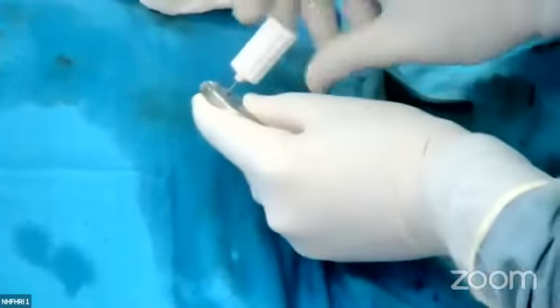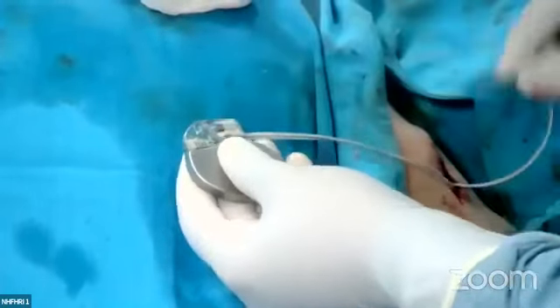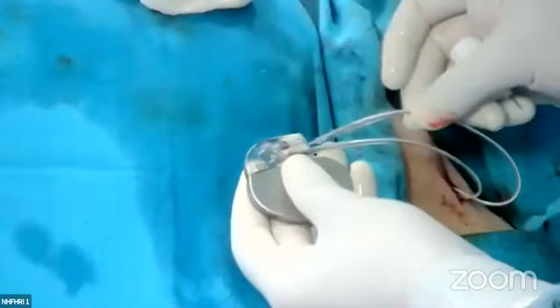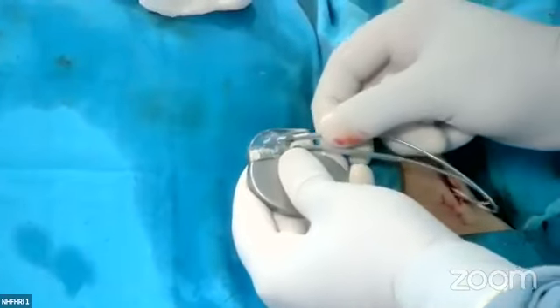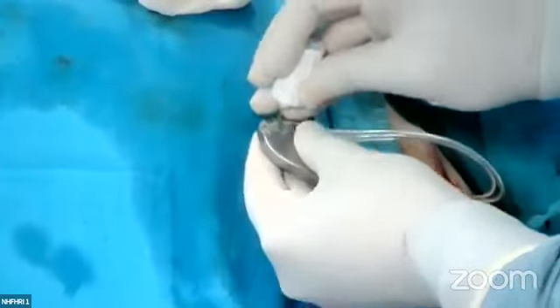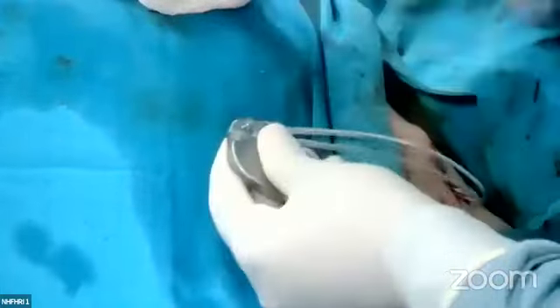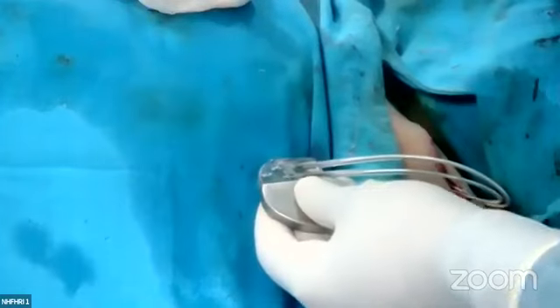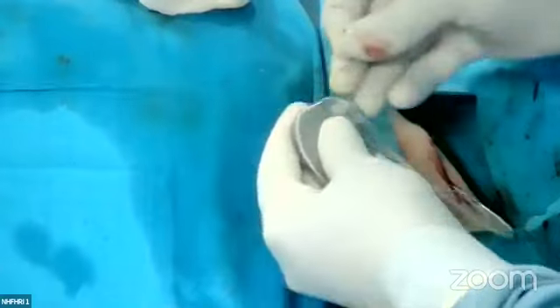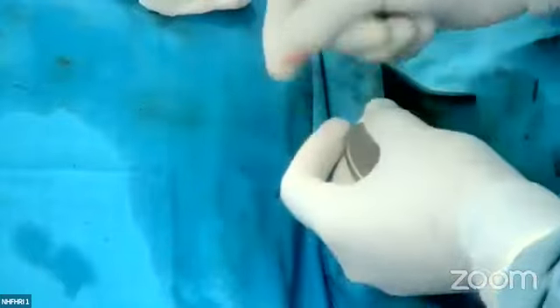So I am fixing the ventricular lead, screwed. Now this is the atria. This is the atrial lead. The atrial lead is also screwed. Now the battery, sometimes with silk, we fix with the muscle so that it does not move downwards. Give the space, please.